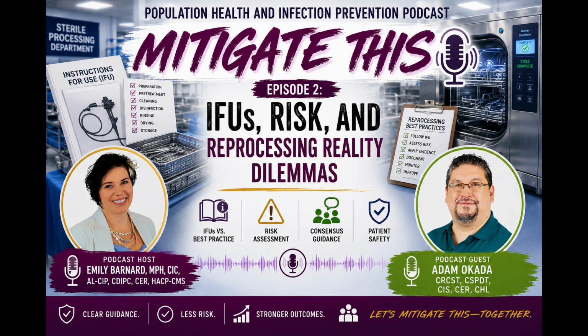So it's really difficult in IP and sterile processing. It's going to be the same thing to get down to what the real answer is, and you can't always just take people's word for it. You really do need to go to what it says in writing, and then ask, can I follow this at my facility? Because that's another thing. Do we have all the materials? Do we have the right machines? Do we have the right brushes to actually process this according to what the IFUs are saying?